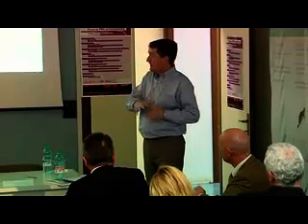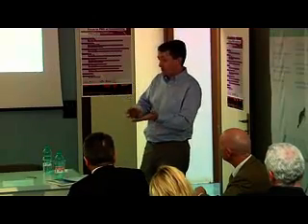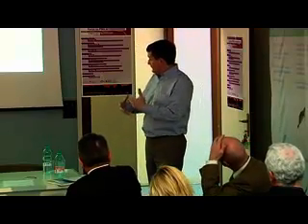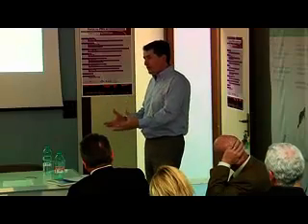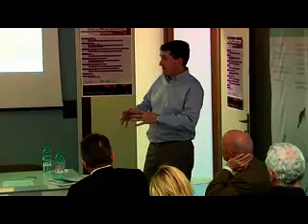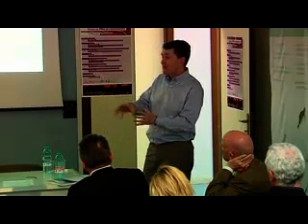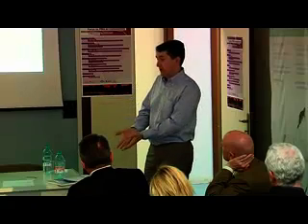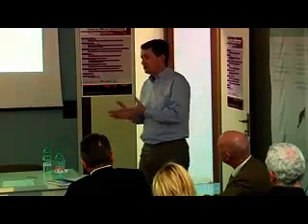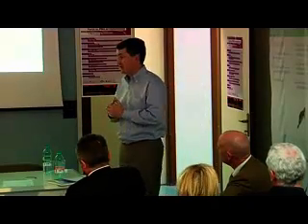And in the early days, when I was a young embryologist 20 years ago, we were freezing embryos on day 2 and day 3 using slow freezing. The technology worked, but it didn't work very well. As embryologists, we would often find ourselves thawing an embryo on day 3, and some of the individual cells would lyse within the embryo. Sometimes all of the cells would lyse and the embryo wouldn't survive. Sometimes 1 or 2 cells would lyse, and we think, okay, most of the embryo is still alive, but maybe its implantation potential is reduced.